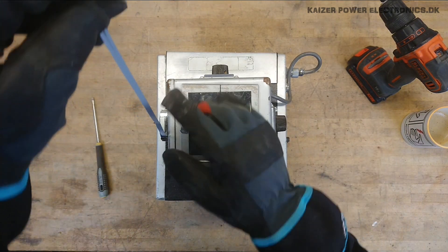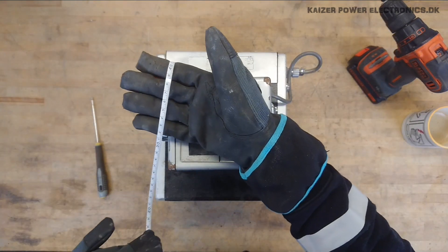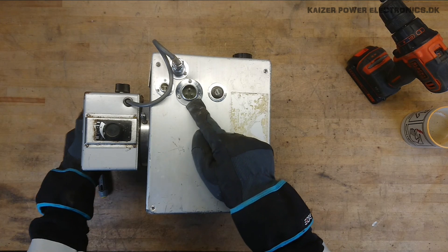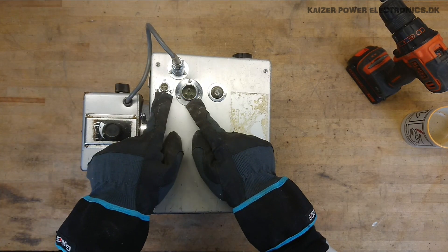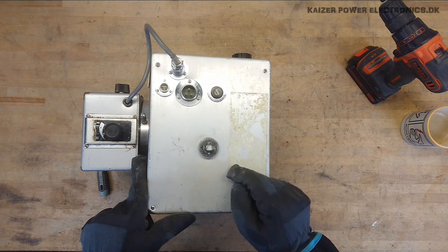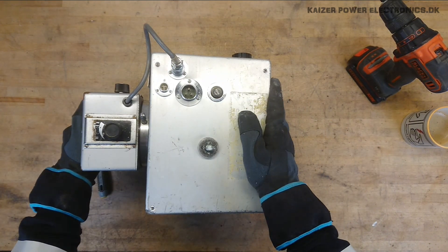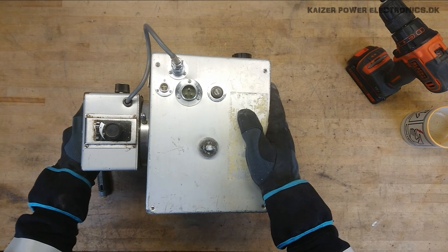It also comes with a small tape measure. At the side here we have the 230V AC input, most likely some kind of remote control, and a fuse. Other than that, the whole unit is just encapsulated. So let's get it taken apart.